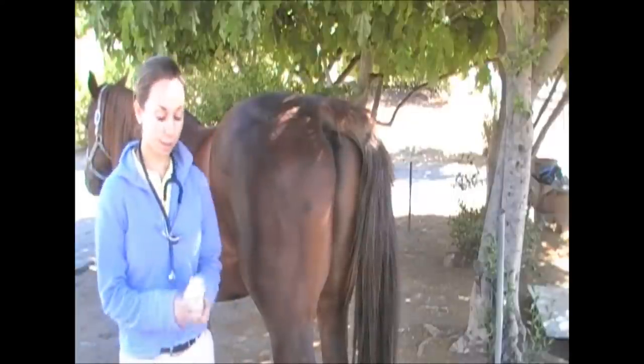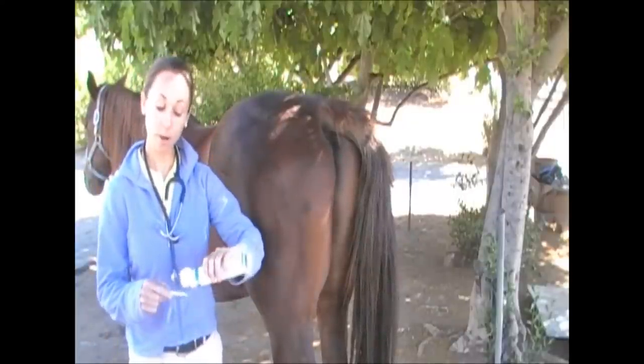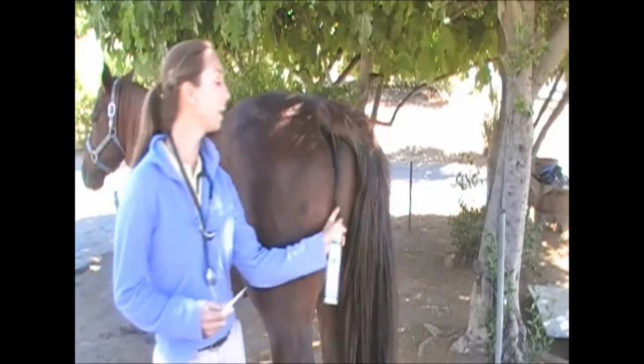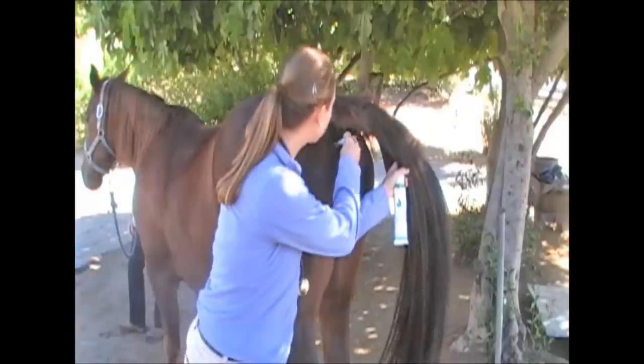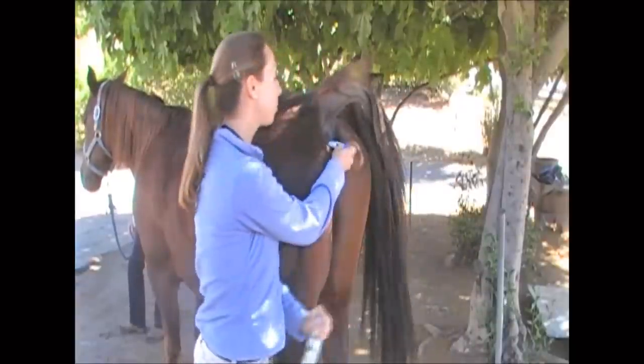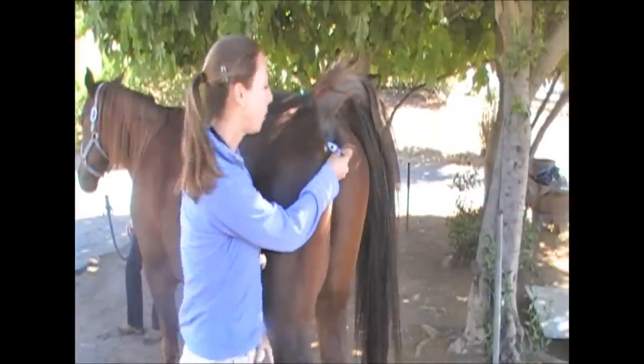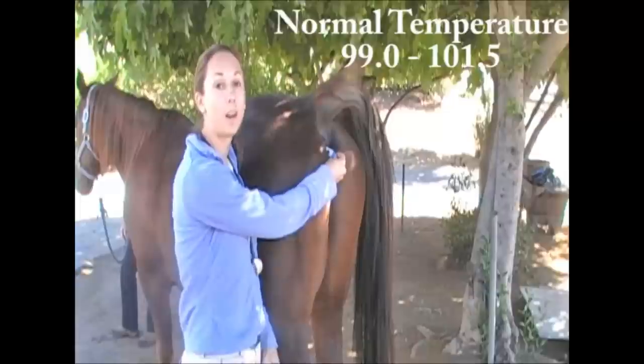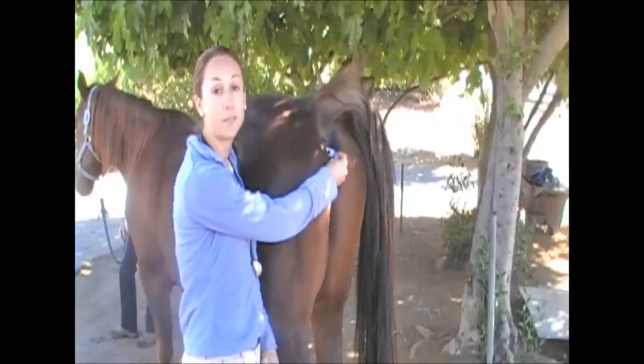Let your horse know that you're next to his side. Apply a small amount of lubrication — it can be KY jelly, Vaseline, or even spit. Lift up your horse's tail and insert the rectal thermometer into his rectum. Press the button to start it and wait for it to come up with the temperature. A normal horse's temperature should be between 99 and 101.5 degrees Fahrenheit.